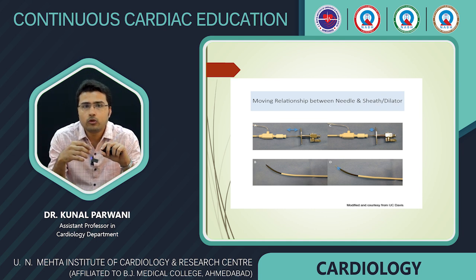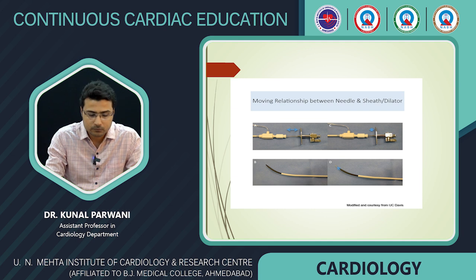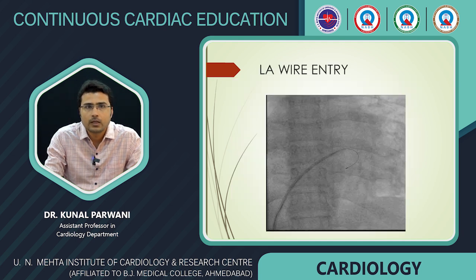And once you enter into the LA, it is better to give puffs of the contrast to confirm the position of the needle, whether we are in the LA or not. Then the needle is removed and the LA wire is entered through the Mullins sheath and dilator into the LA.